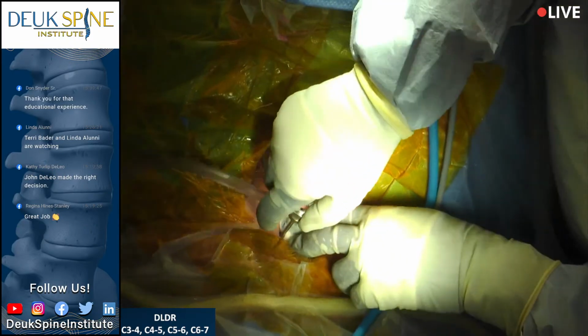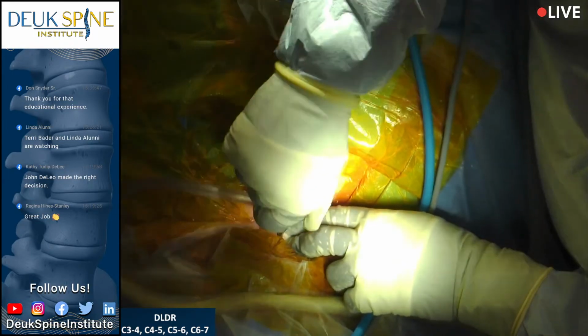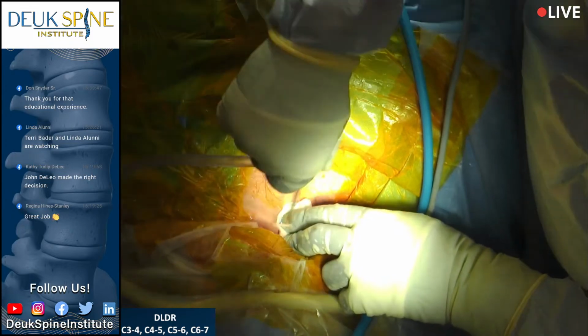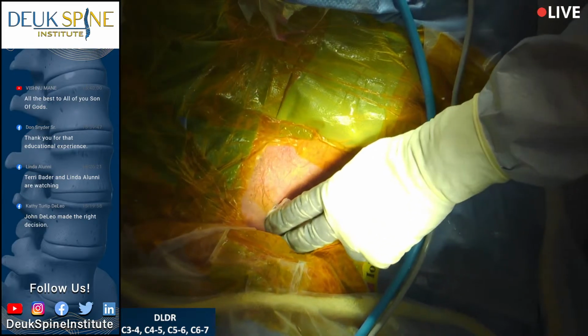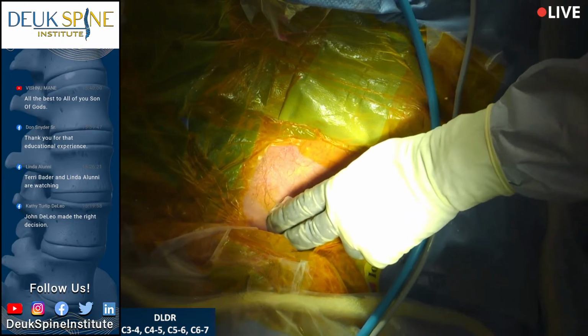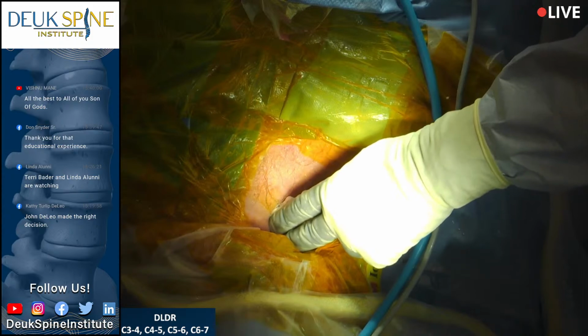All right, I'm going to show you this incision in just a minute. I got to take the tube out, and we'll be done. Okay? Remember, it was hard to get in, so it's going to be hard to get out too. I'm going to hold pressure as I always do, give it a few minutes, and then I'll show you the incision. And we're pretty much done, Doc. Nice job. He's doing well. Yeah, how was his airway?